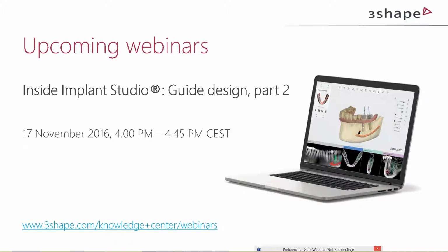If there is a good reason why we should name them according to the case, so basically add patient names, please let us know. I'll be very happy to pass this information on and see if we can add it to the next upcoming releases.